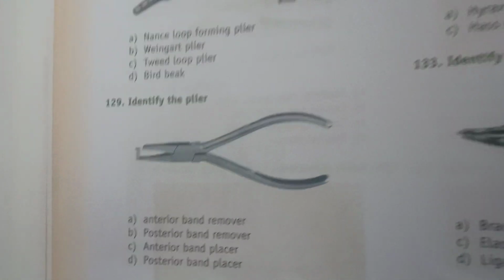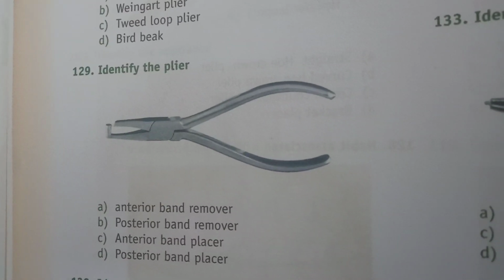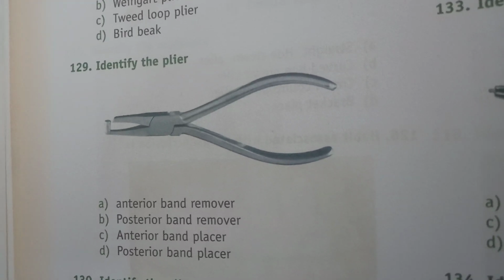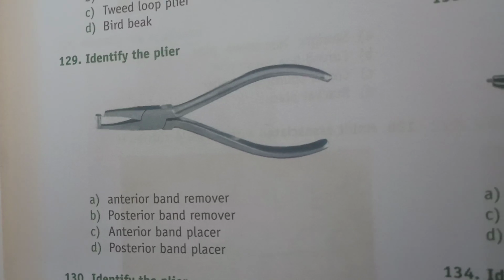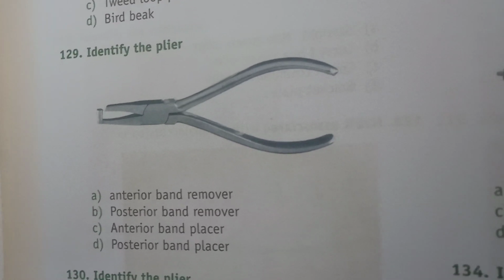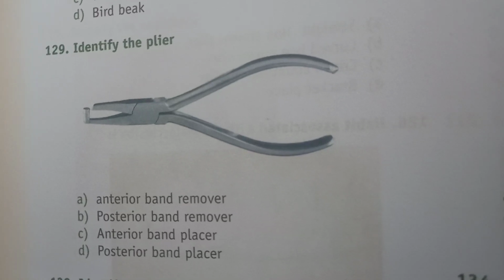Next, this is also you have to identify the plier. Look carefully. Is it anterior band remover, posterior band remover, anterior band placer, or posterior band placer? The answer is B, posterior band remover.